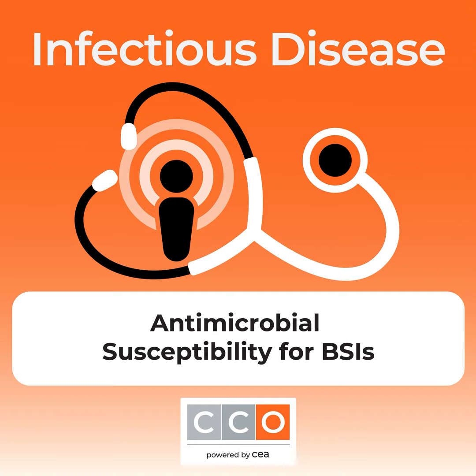And in this particular case, on day 2, the patient was responding well to treatment, with normal renal function, no fever, and improving white blood cell count, and the E. coli was confirmed in the urine culture using MALDI-TOF. So we know the other clinical information, and in a very simplified way, would you de-escalate meropenem based on the rapid diagnostic, in this case the BCID, since the E. coli didn't have any gene detected? Do you continue with meropenem or do you de-escalate from meropenem?